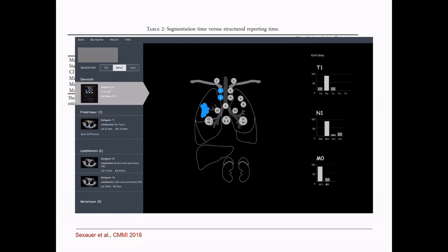The depth of our knowledge or our patterns is very shallow. We don't remember 10,000 cases. We remember the ones we got wrong. So we have a negative bias, especially with lymph nodes. If you made a mistake once and you see a small change in a lymph node, you will always say it's suspicious, and that means something, because if you say it's suspicious, it needs to get biopsied, and it may be in a tricky position. So I think it's really important to provide statistical information about the probability of something going on.